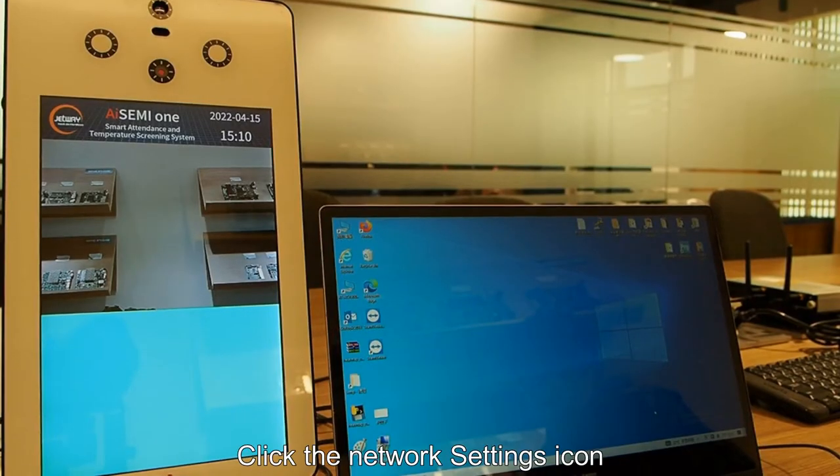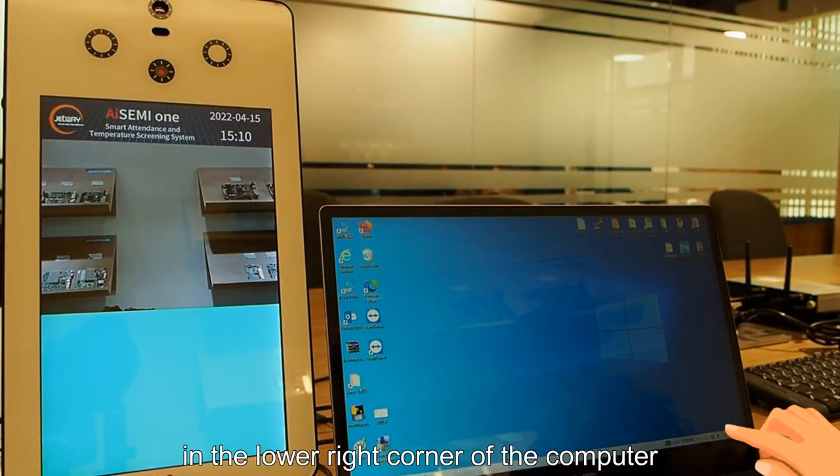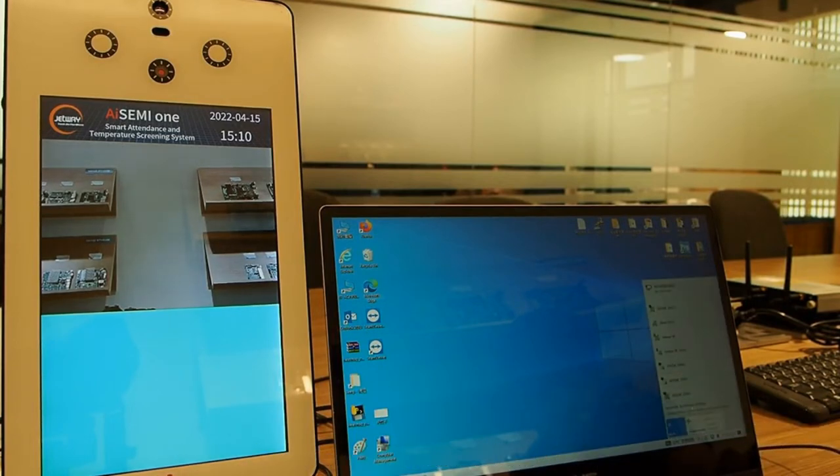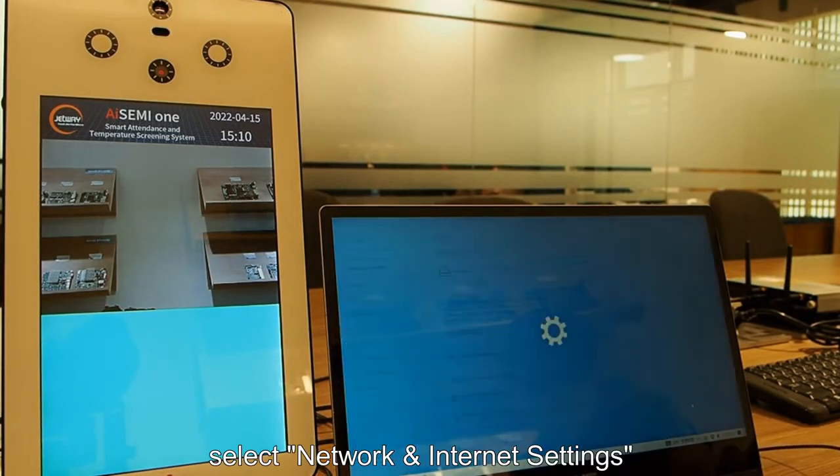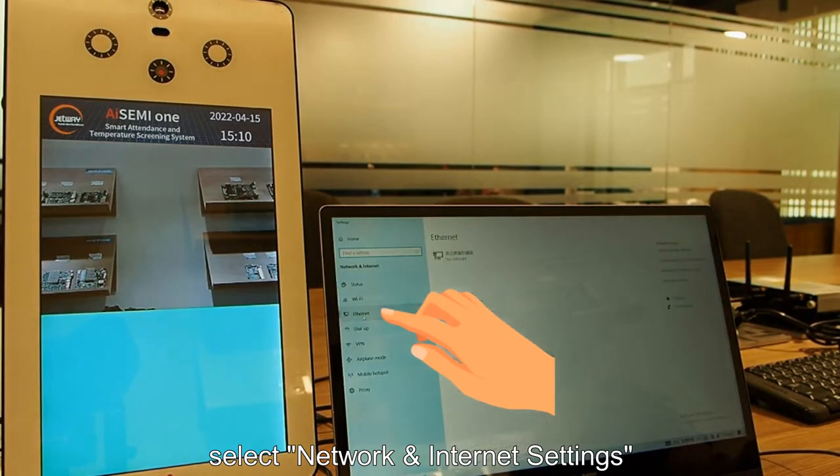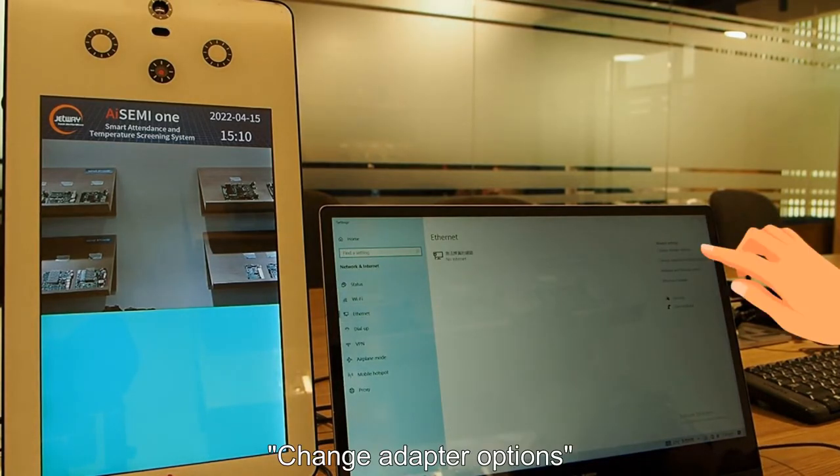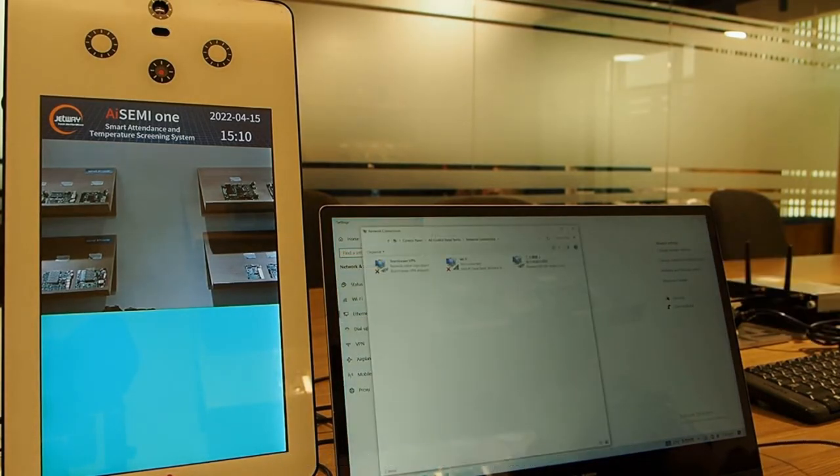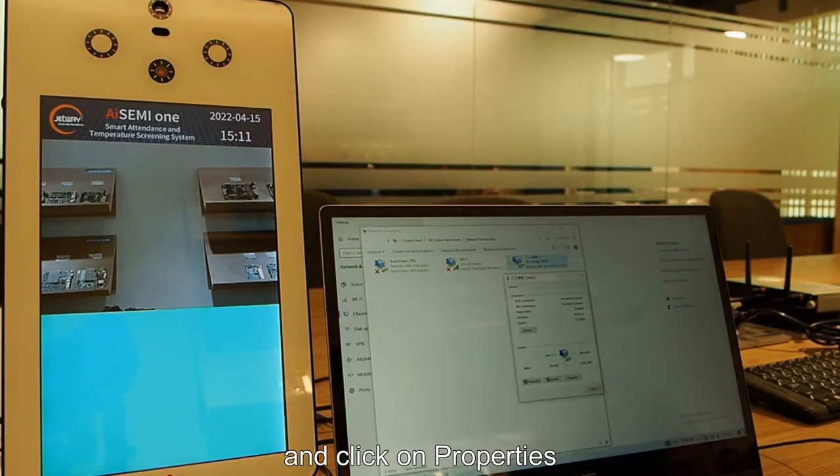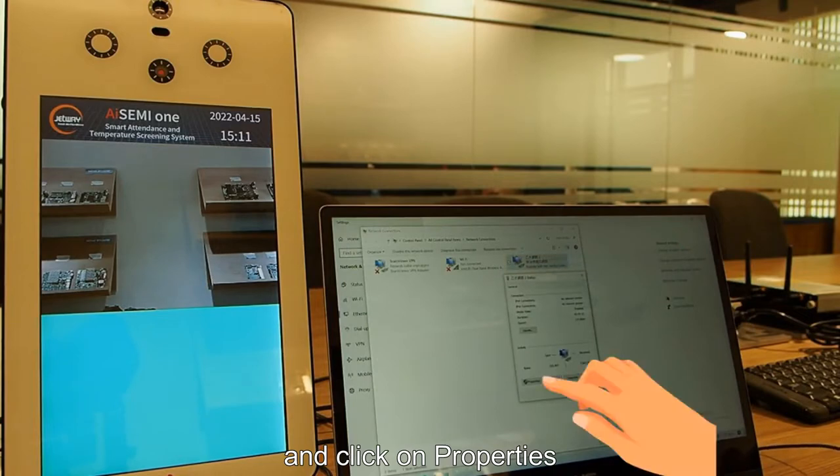Click the network settings icon in the lower right corner of the computer. Select network and internet settings, then change adapter options.